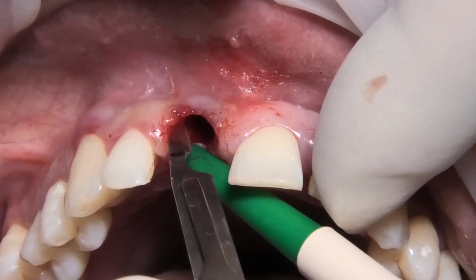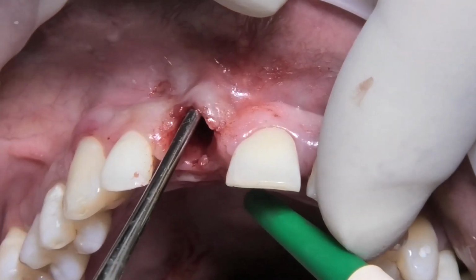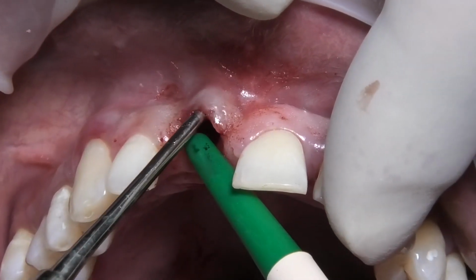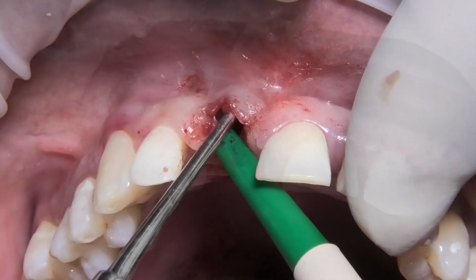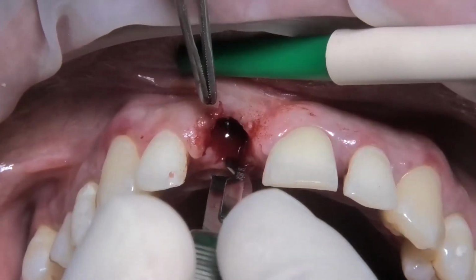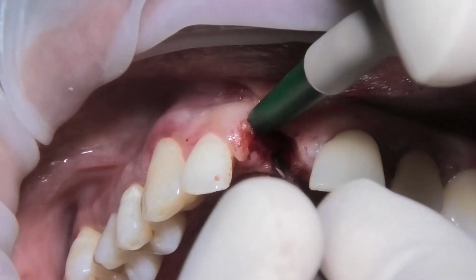With a small periosteum elevator, type Molt, we can perceive the bone walls apical to the defect and mesial and distal, in a manner to isolate the bone defect to then facilitate the insertion of a collagen membrane. So we also collect the palate area, always with the scalpel and periosteal elevator.